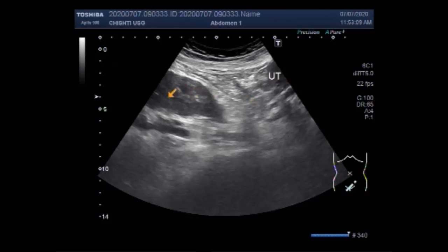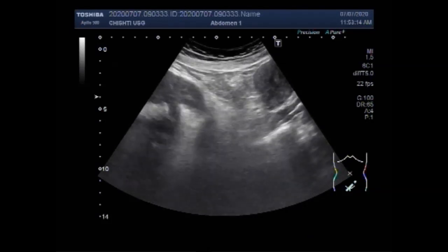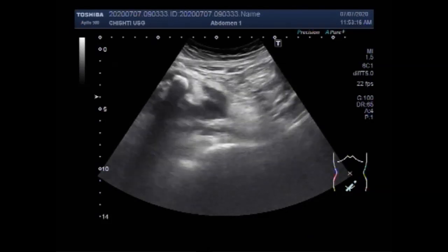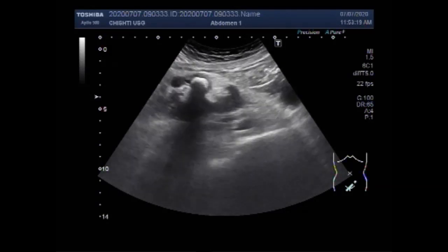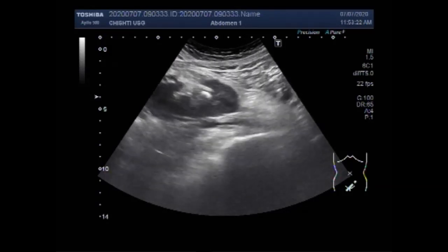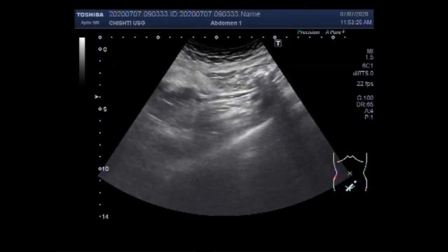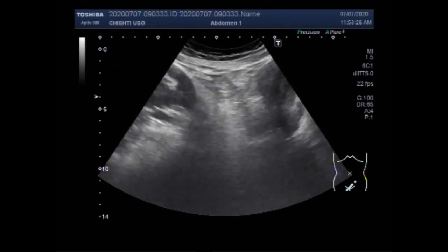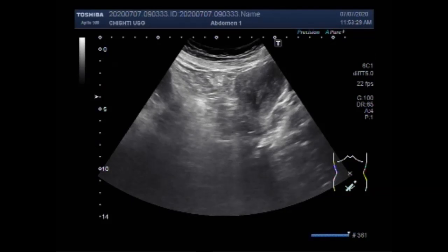This is the ureter and this is the left kidney. This is the stone in the upper one third of the ureter of this ectopically placed kidney, and a stone is also seen in the renal pelvis of the kidney.